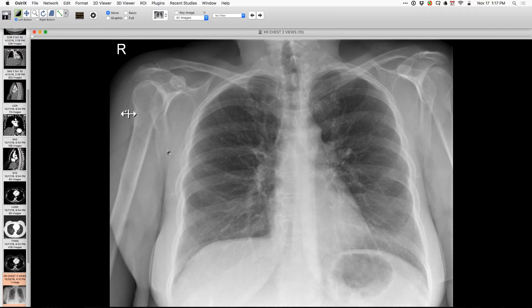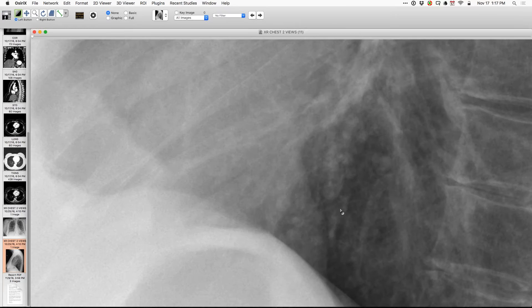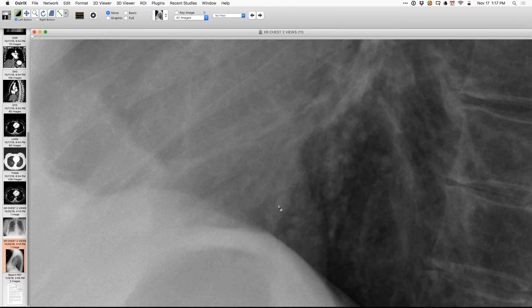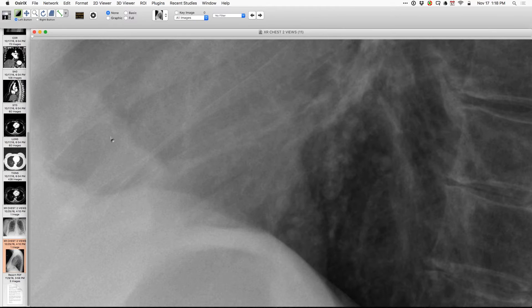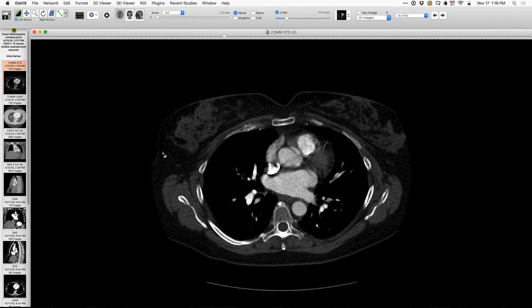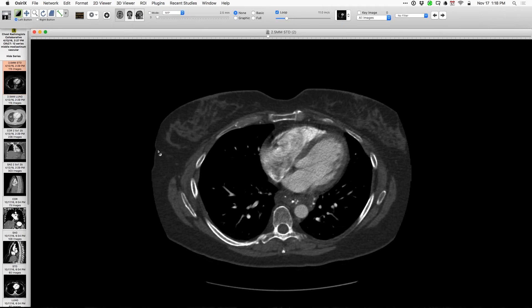The next presenter shows a chest radiograph where the finding is subtle, best seen on the lateral projection — small round nodular objects superimposed on the heart. This patient had a known lesion in the mediastinum previously biopsied as some kind of granulomatous lesion, though the biopsy sample was not great, leaving diagnostic uncertainty. Symptoms of dysphagia and other ill-defined symptoms have been worsening.